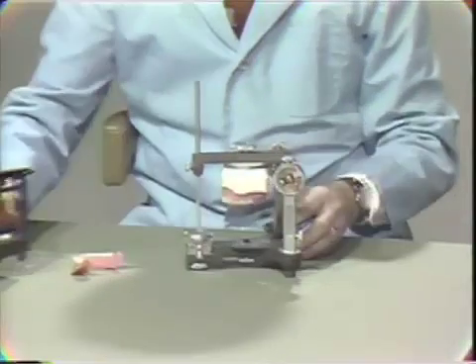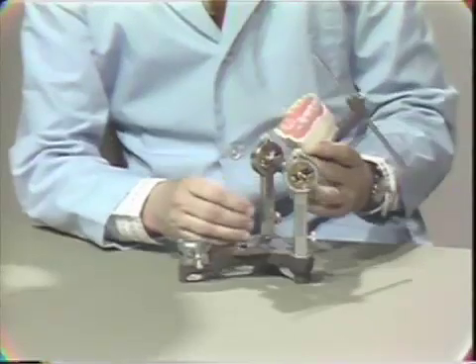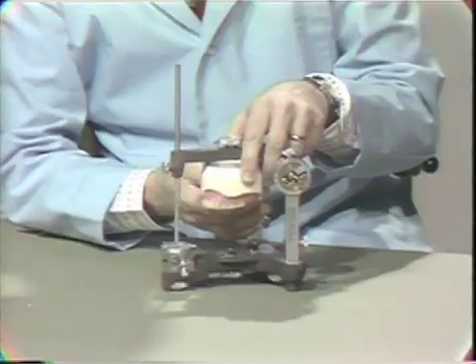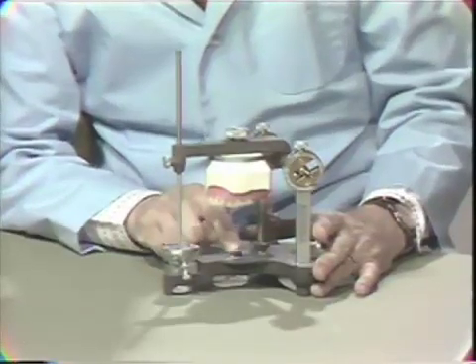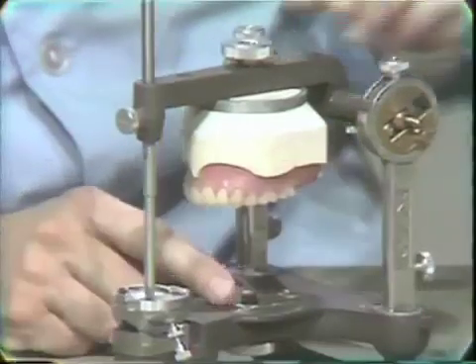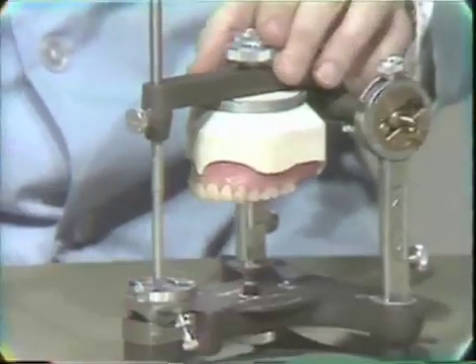Let me demonstrate that now. This is a case where the wax denture is completed. The lower has simply been taken off. So we don't have to take a new face bow transfer from the patient — all we need to do is attach an index of the teeth to the lower part of the articulator so we can put the processed denture back in the proper relationship to the opening axis of the condyles.